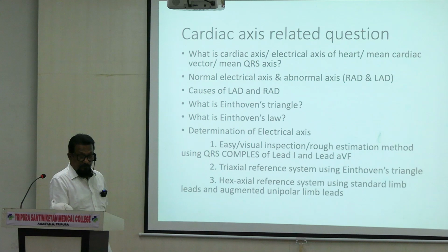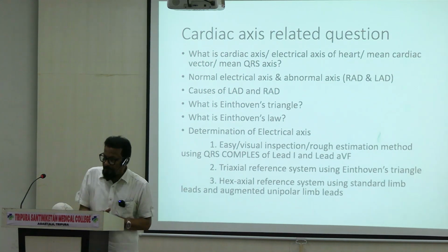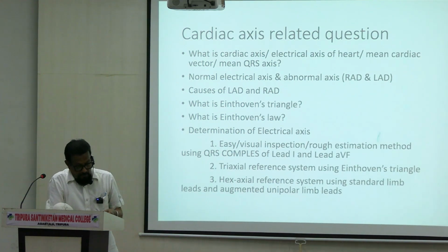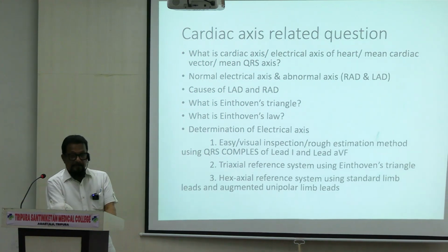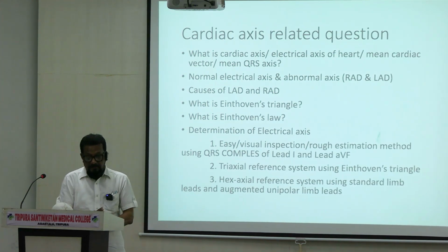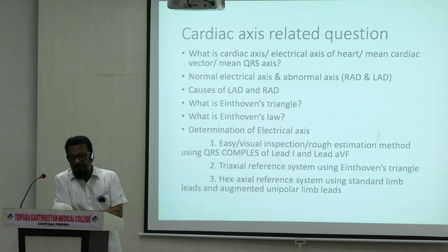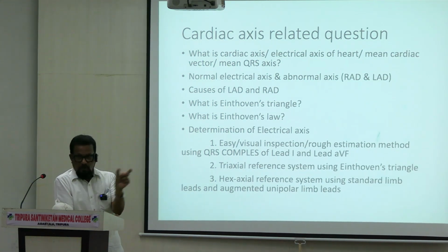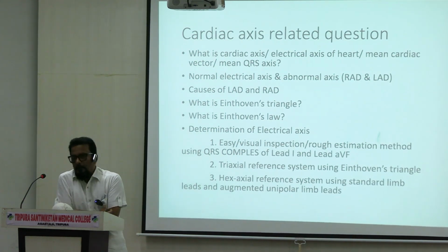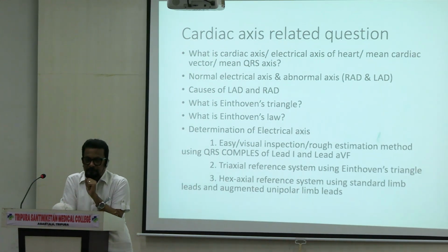Okay. Before I start elaborating on the cardiac axis of the heart, I want to again explain in a very short way what we mean by ECG. ECG is electrocardiography, by which we record the electrical activity of the heart. Okay, so it is the method.